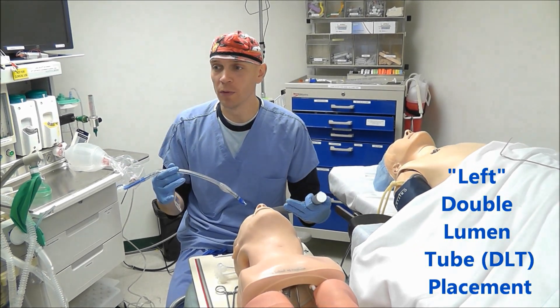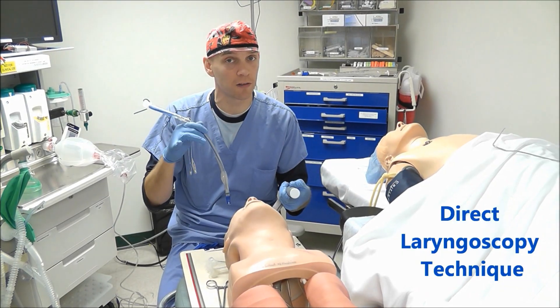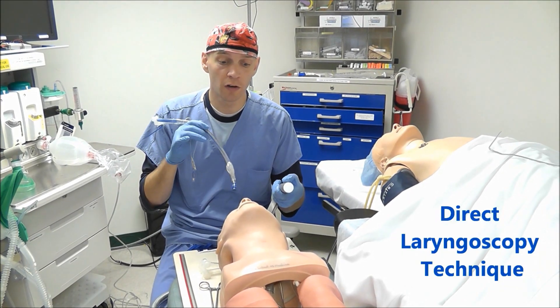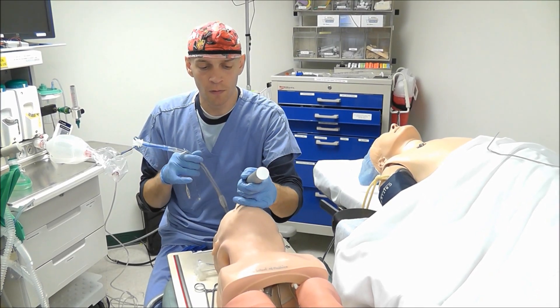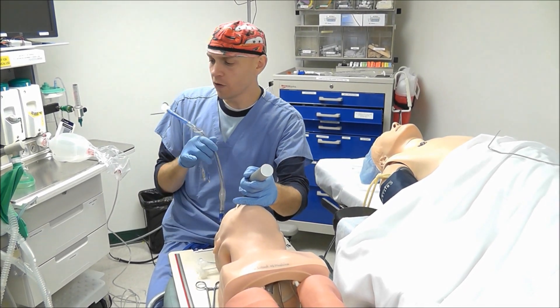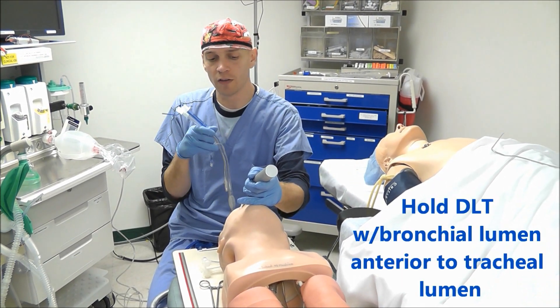Today we're going to go over double lumen tube placement, and the technique I'm going to show you is direct laryngoscopy. When you're going to insert a double lumen tube, you go ahead and do laryngoscopy like normal. Then when you're ready to insert the double lumen tube, you're going to want the bronchial lumen in front of the tracheal lumen.